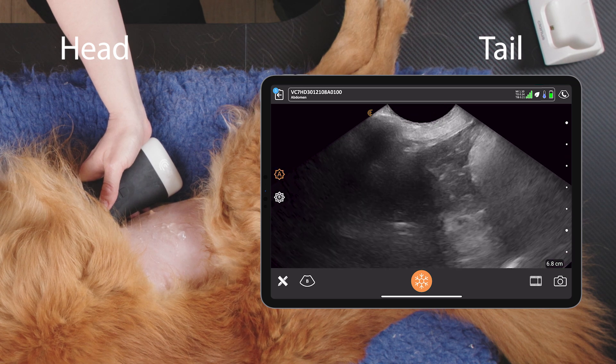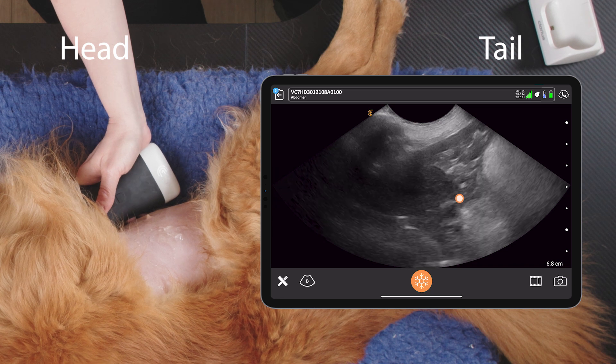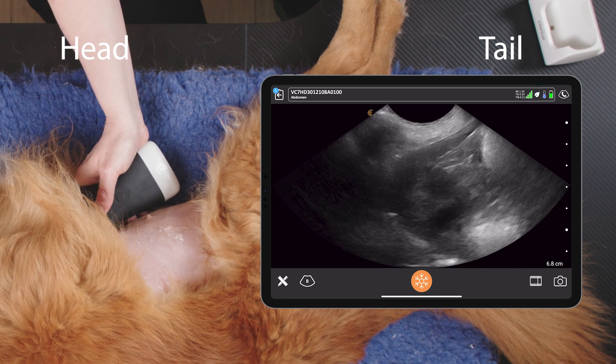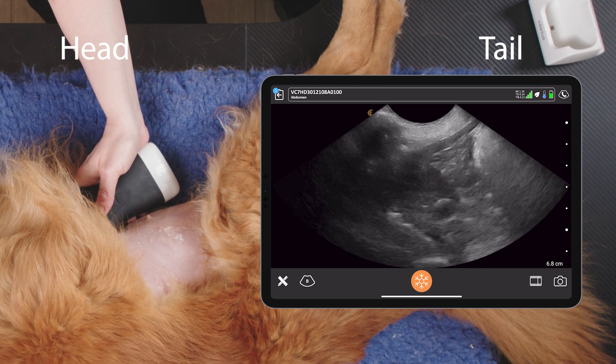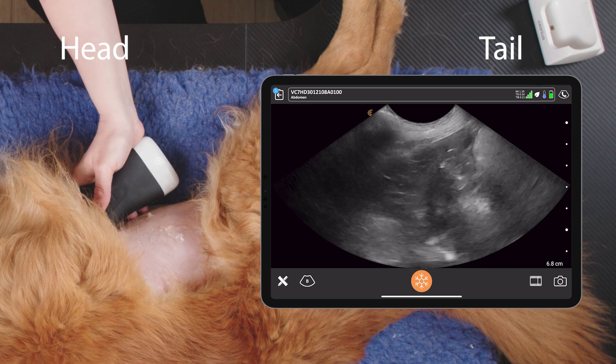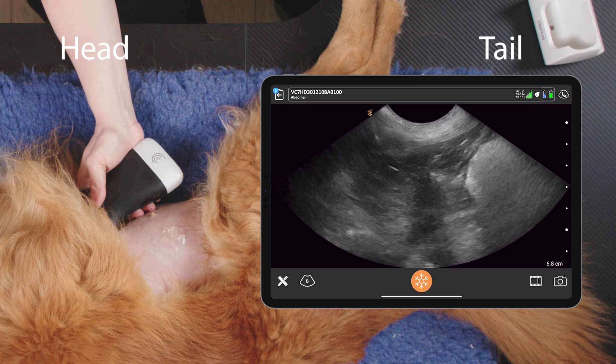We want to optimise our image for seeing the gallbladder, and here we'll see any sludge. Pippi has had breakfast, so her gallbladder is quite small here. We can also fan through and try and look in a couple of planes.